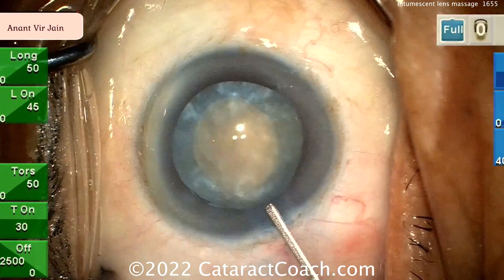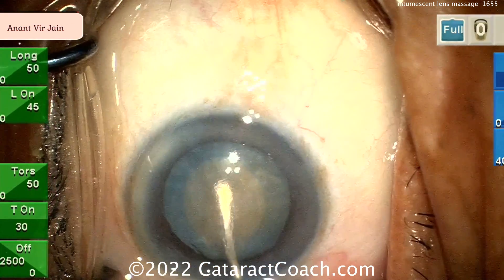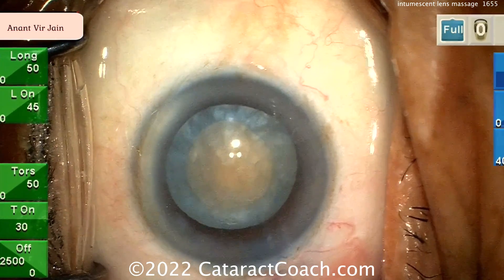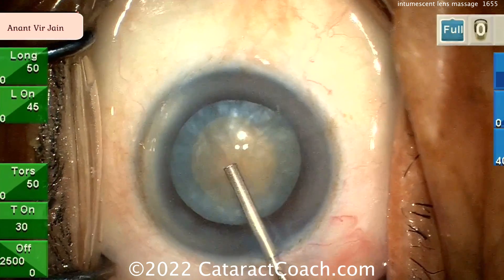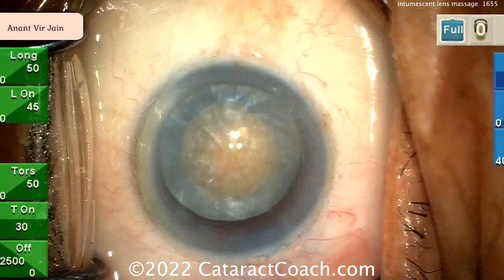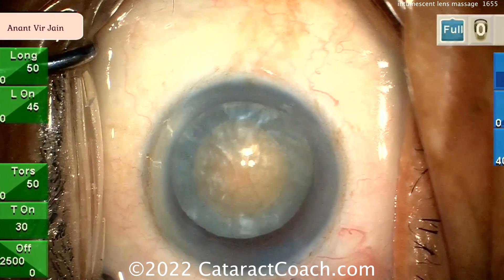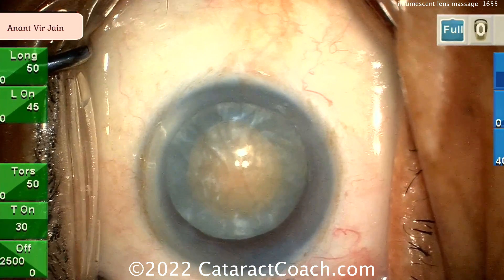Importantly, don't do aggressive hydrodissection — be cautious. Very little, if any. This nucleus often, and most times, will spin on its own anyway with zero hydrodissection, because remember the lens cortex has all been liquefied already. I like that re-coat of the endothelium with the viscoelastic — that's a smart move.